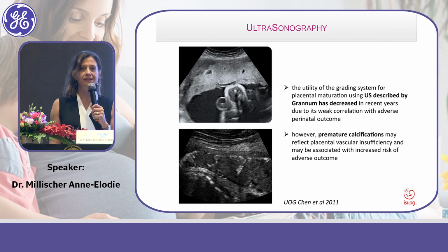But we have to know that it's very limited to assess the function of the placenta.